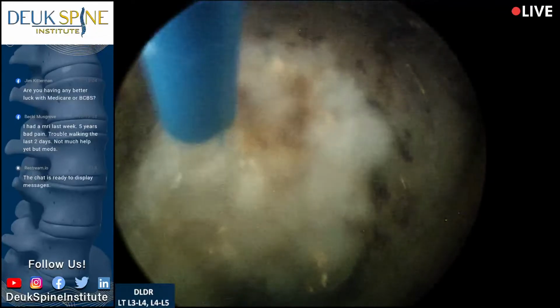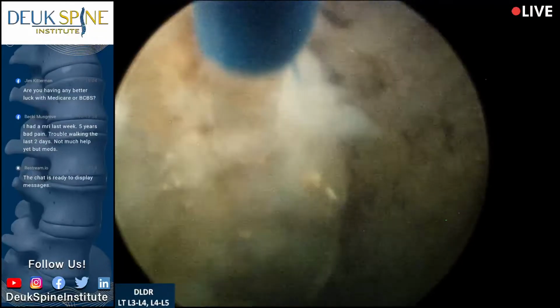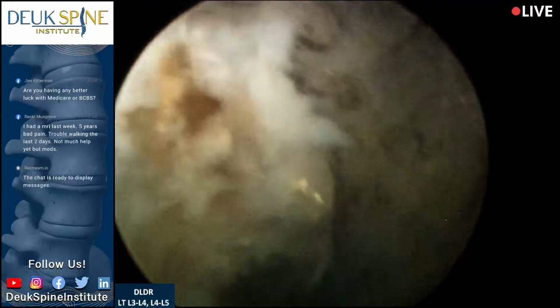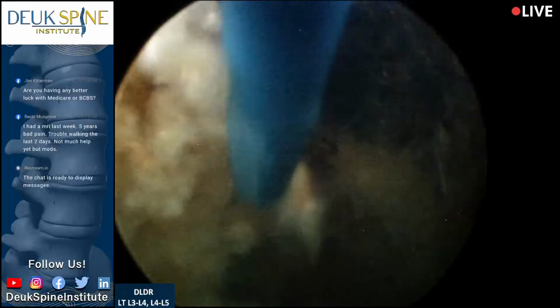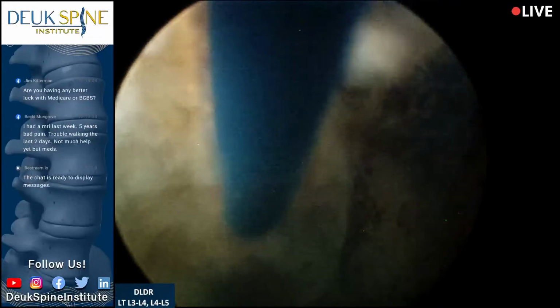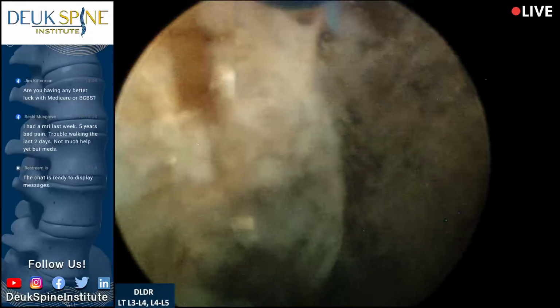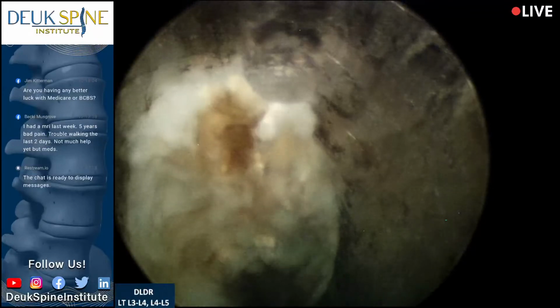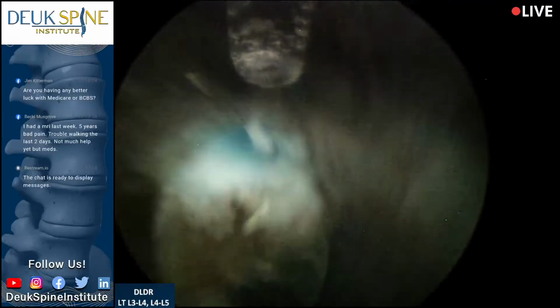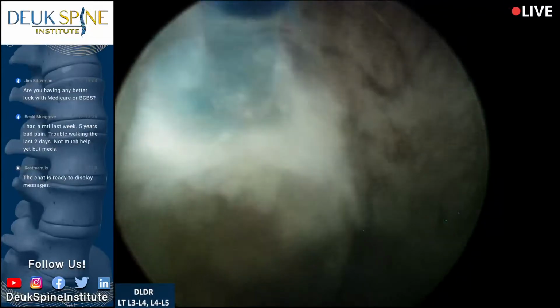By not moving, you're going to get rid of that disc pain once you clean out the disc and stop them from moving. Like any painful joint full of arthritis and inflammation, you can stop the pain in that joint by stopping the joint from moving. Another option would be to cut the joint out completely and put an artificial joint in there that's made of metal, because metal on metal won't hurt. You won't feel it. There's the tear, by the way, the annular tear with the blue herniation.